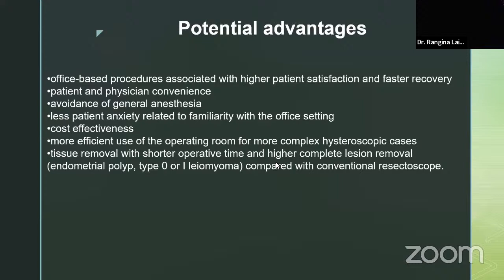slightly costlier because the instruments, we all know, are very costly, and we don't make them here. We get the instruments from India only. So it is slightly higher in cost, and there are few doctors who are doing hysteroscopy in Nepal. It is a more efficient use of the operating room for more complex hysteroscopic cases.